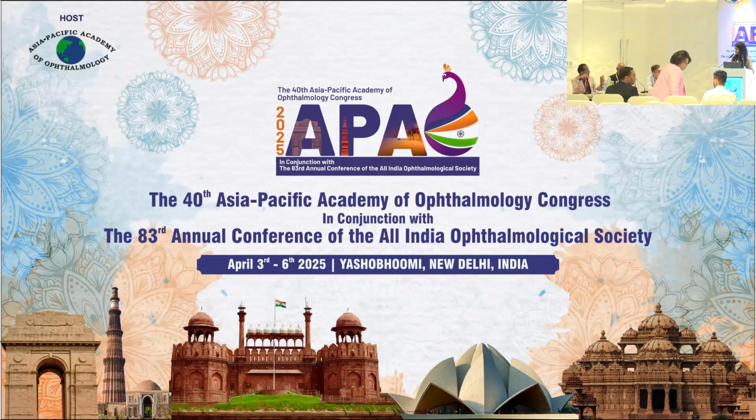Dr. Bayala, you'd like to ask something? I think the Lensar in particular is a good machine in this respect, that we can mark where to place the lens, which is very important in cases of toric lenses.